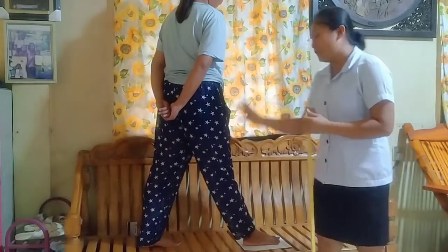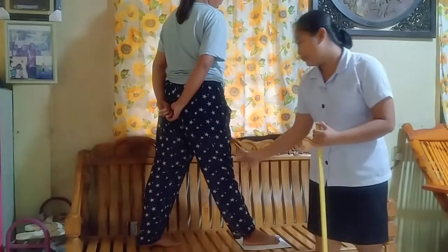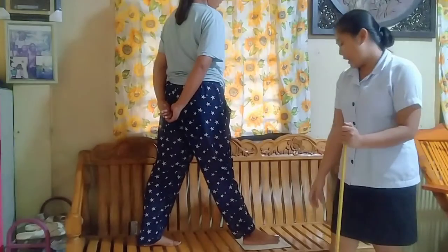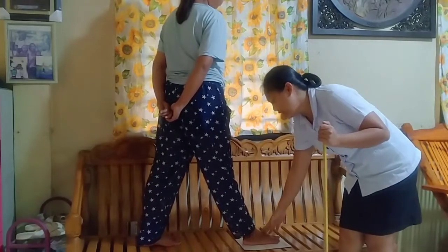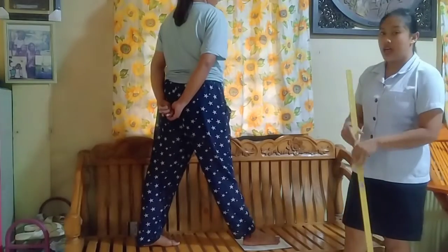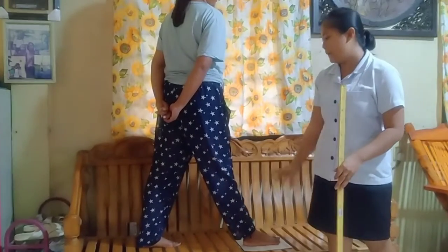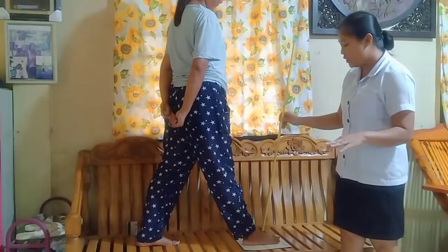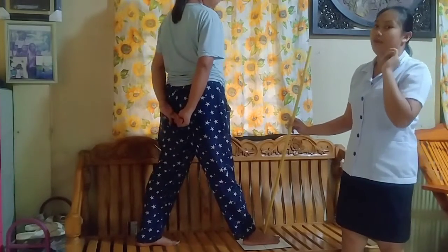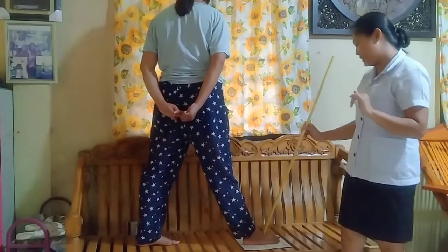Now, instruct the patient to move the affected side forward 1 step, placing it in contact with the IR. Now, since this position, we will be decreasing the SID to 40 inches.